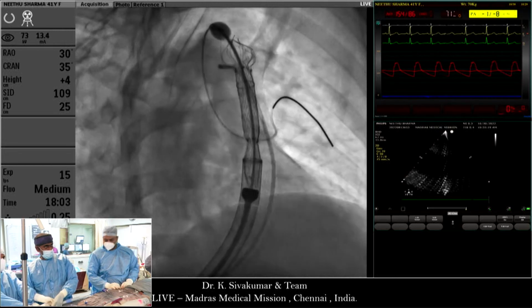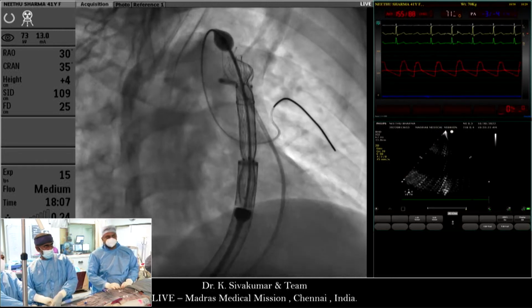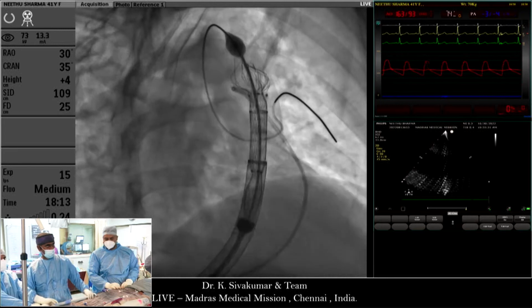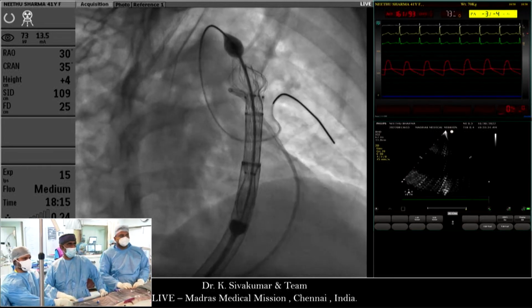Yes. To me, it looks too high. Overestimation. Varakan, does it look too high to you? Well, it's a bit RVOT deep, but I think he's coming back. Do they use 10 millimeter calibration? So now give another injection.